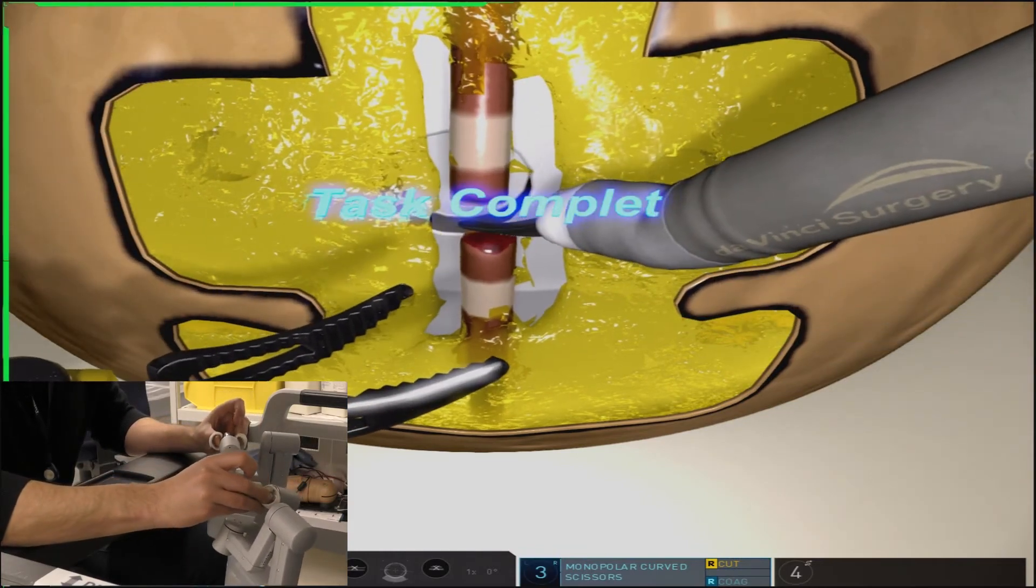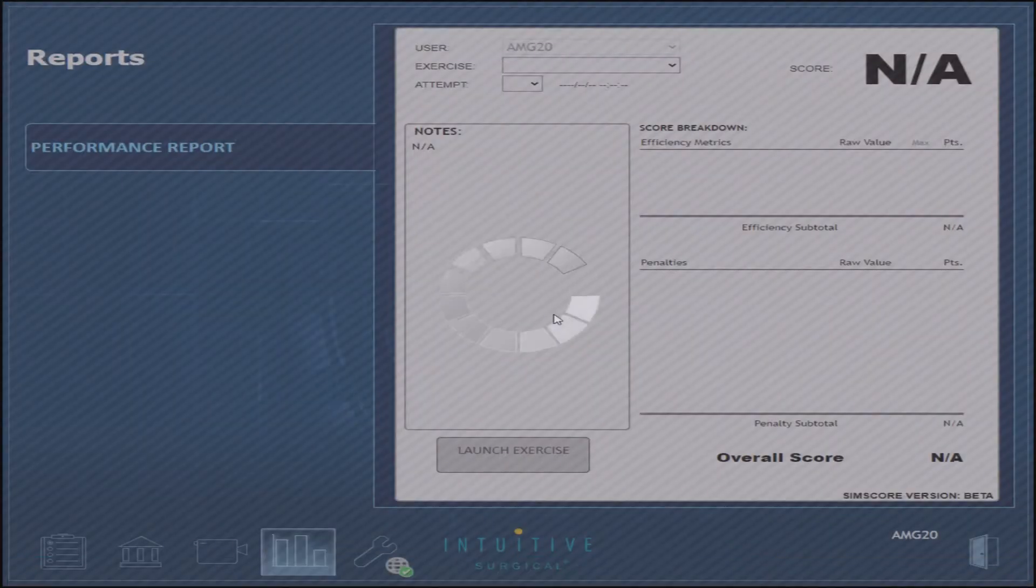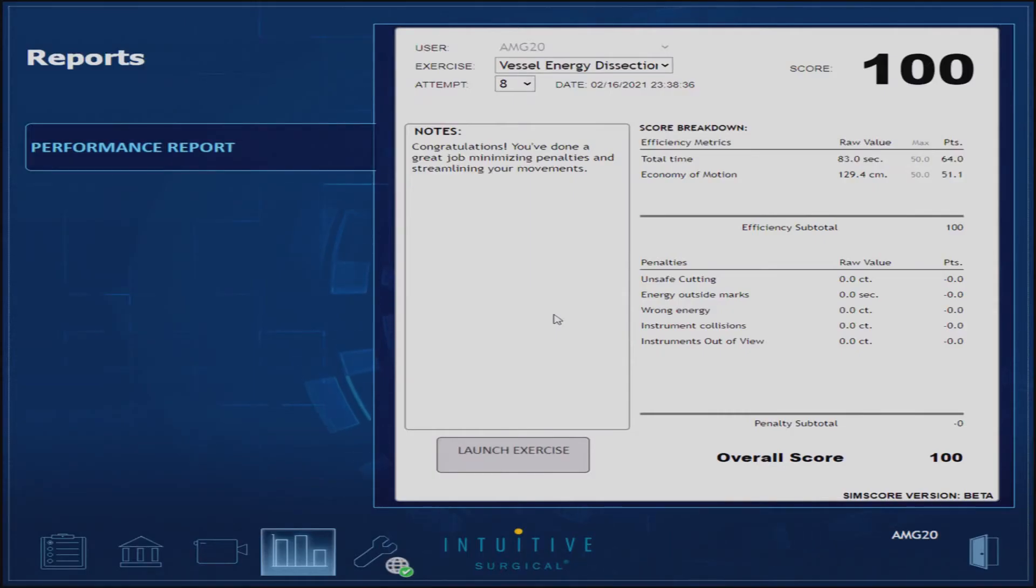Once deemed satisfactory coagulation, the exercise will prompt you to cut in the middle of your two coagulation points. Try to avoid injuring the vessel during your dissection or providing excessive tension.